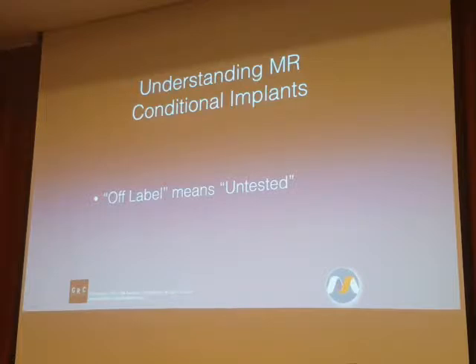Good luck trying to do a fast spin echo on that patient when you have 0.2 watts per kilogram. Maybe you get one slice with such a restrictive RF condition. So they put out this ridiculously low threshold value.